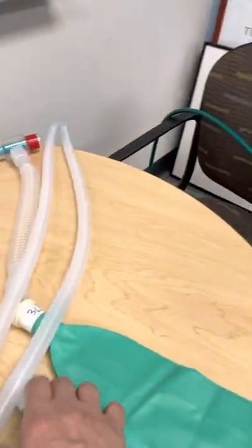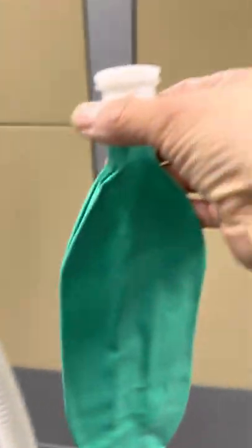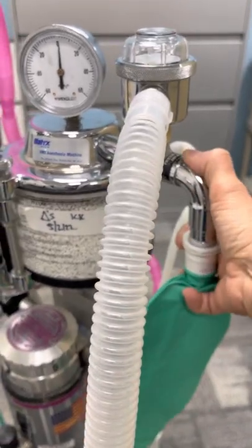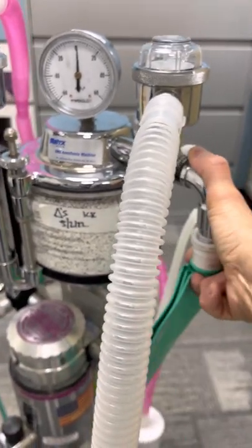Okay, then we are going to pick, let's just say we pick our 2 liter bag, and that bag attaches right here. And we'll go through this whole circuit here in a second.